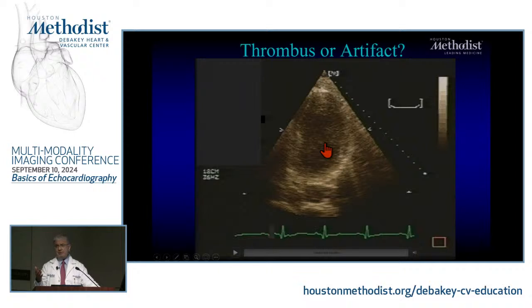What you would try from a sonographer point of view, and that's why for all of you, you have to train in addition to interpret. Fellows usually gravitate first towards the actual machine station before you start interpreting the studies, because you need to understand what you're looking at, right?